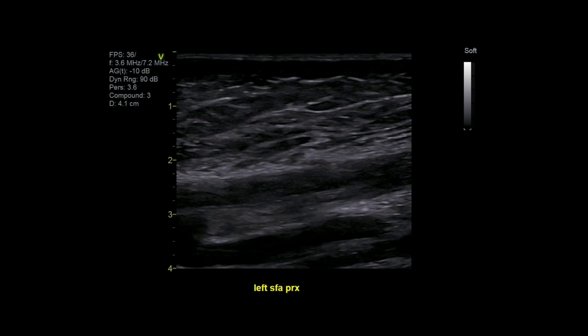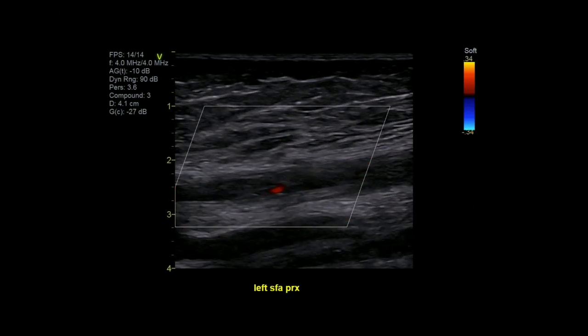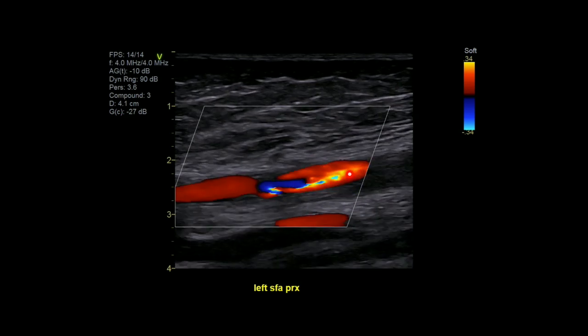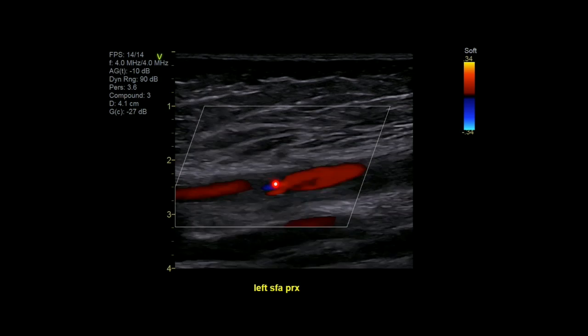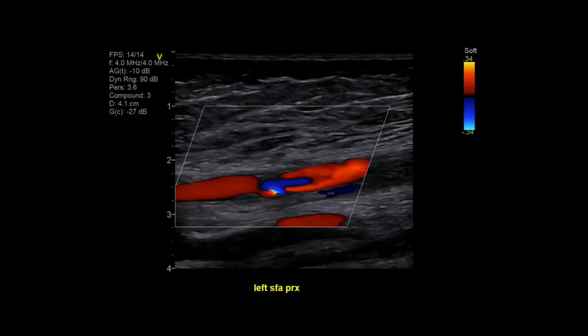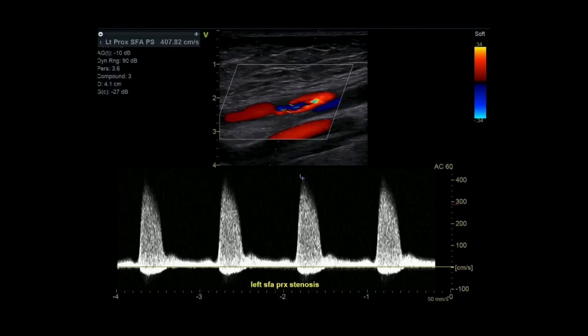So then we would utilize the color flow function, and we're going to look for aliasing of the color flow. And as you can see right there in the middle of our lumen, we see aliasing and a narrowing of the plaque right here to the left. In this situation, I would want to utilize the spectral pulse wave Doppler and get a sample of what that velocity is within that lumen. You can see that the velocity is over 400 centimeters a second.